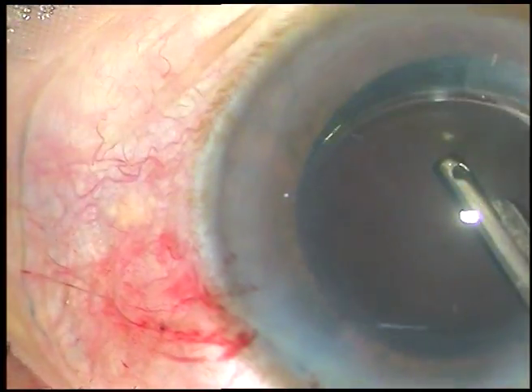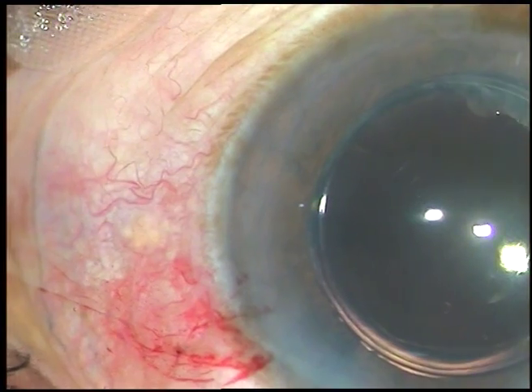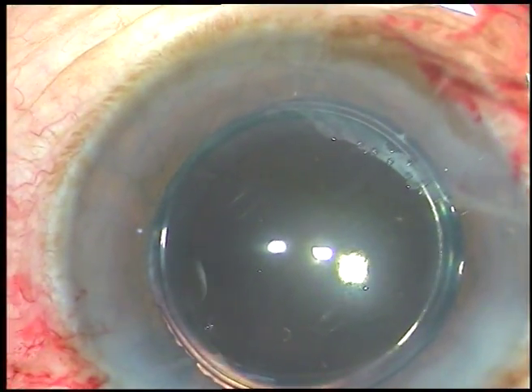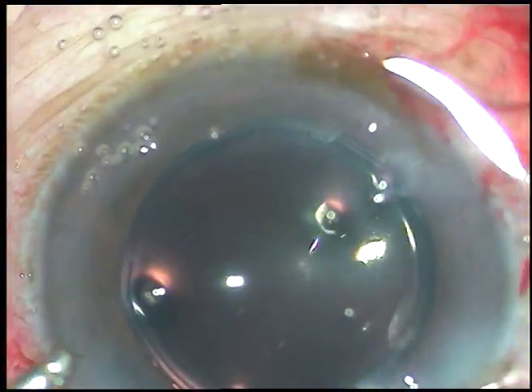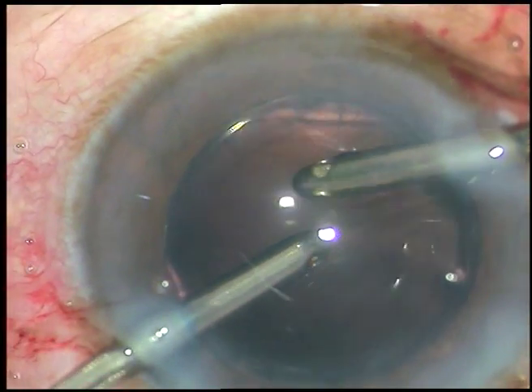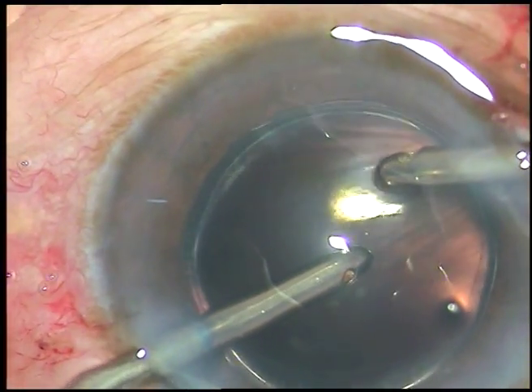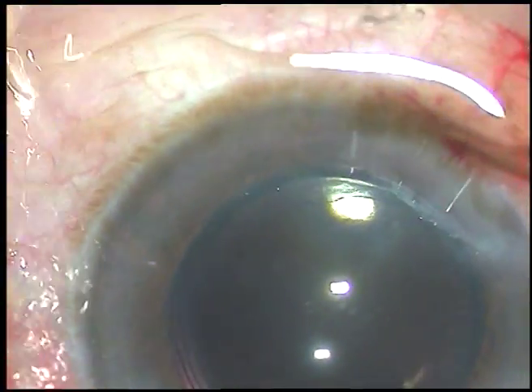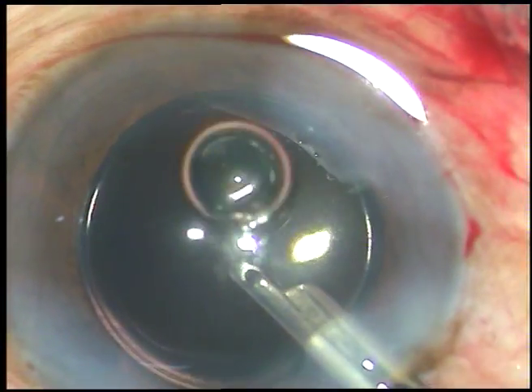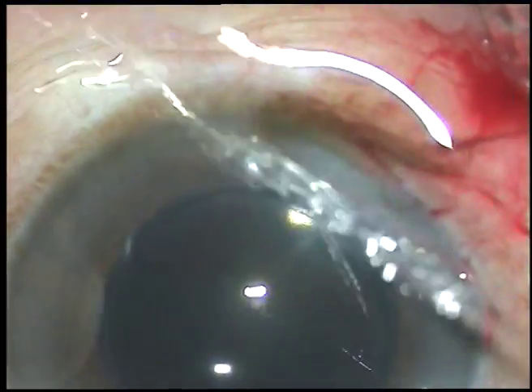This is a thorough removal of viscoelastic substance, but this is not my ritual. After this, I use bimanual irrigation-aspiration for thorough removal of all the molecules of viscoelastic substance — irrigation first, then irrigation and aspiration together. This is done religiously because if you do it nicely, the intraocular pressure will not shoot up. IOP will remain normal and the patient will be very comfortable. Then the side ports are hydrated, the final lavage of the anterior chamber is done, and the wound is formed and the case is concluded. Thank you very much.